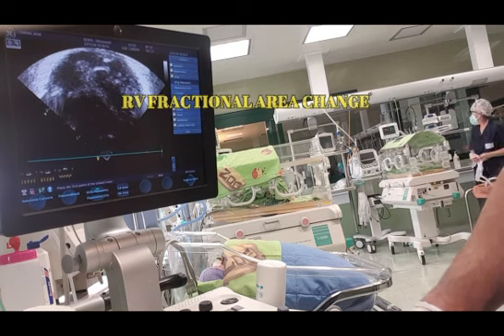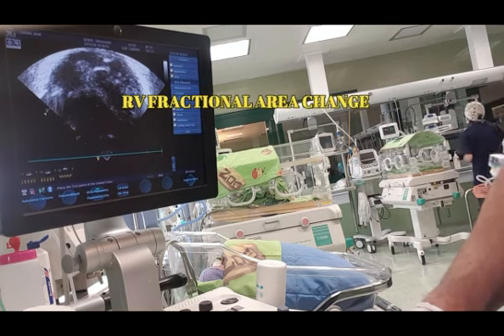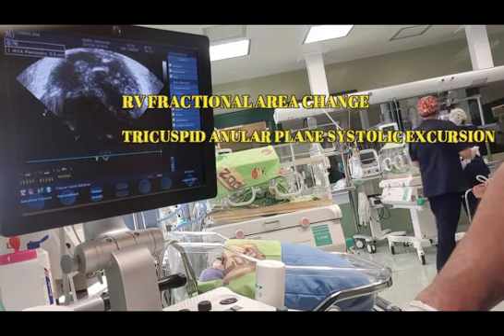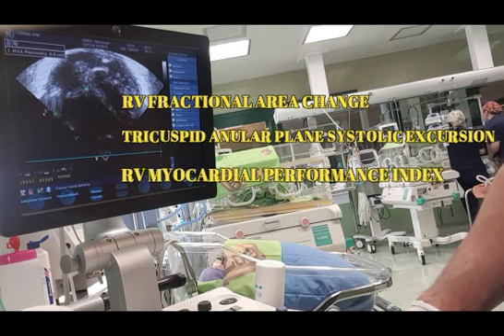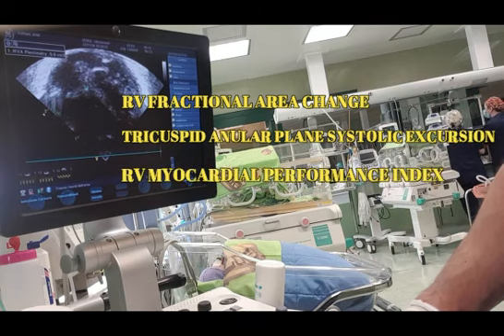Right ventricular fractional area change, tricuspid annular plane systolic excursion, or right ventricular myocardial performance index.